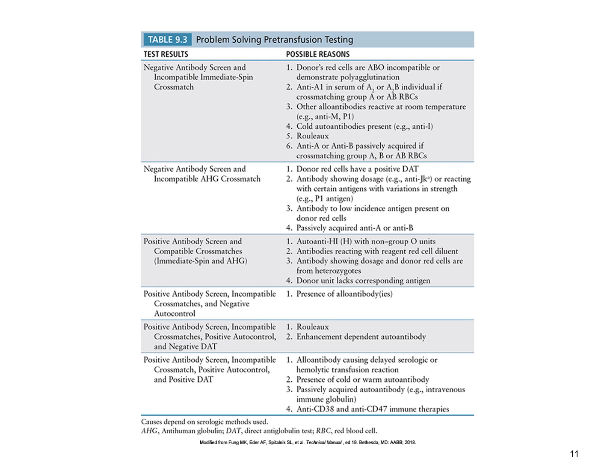Don't ask me how it happens, but it happens. And when you get situations like this, if the patient is really in need of blood, you kind of have to go through all the process, give them antigen negative for what they could have an antibody to. You go through doing the various absorptions and things like that, and you basically get the safest product possible and hope and pray for the best outcome for the patient.